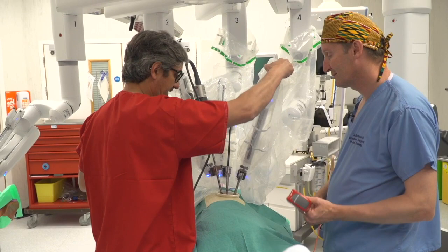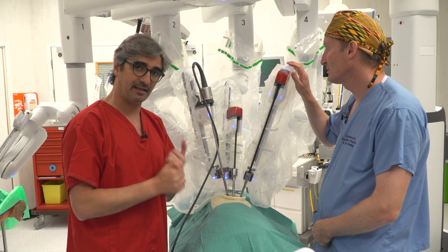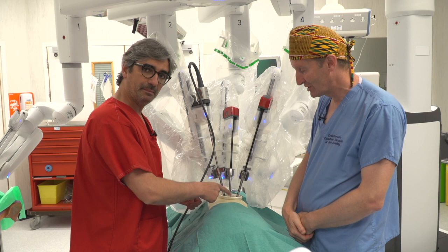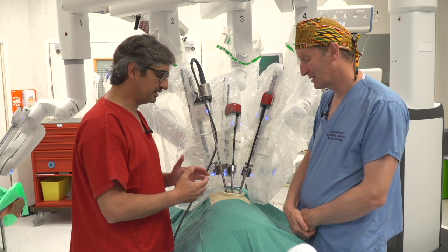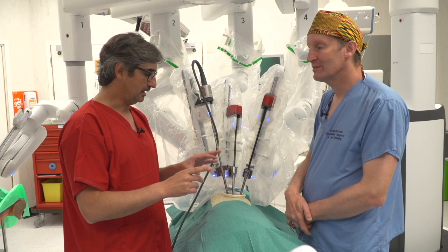Important, very important. In uniportal RATS, we have two ways of doing it. One is hybrid uniportal RATS, which is a technique that is not pure RATS, because that means that we use the robot for dissection, but then the bedside assistant uses the VATS staplers for dividing the vessels and the fissure. So this is a hybrid technique, which is not our concept. Our concept is to do everything uniportal RATS, complete pure RATS. That means that the surgeon at the console uses the staplers, uses dissection, uses everything. And this is more important because the main surgeon can control everything.